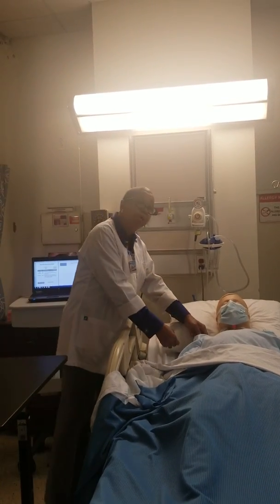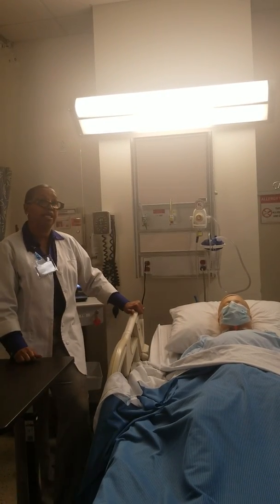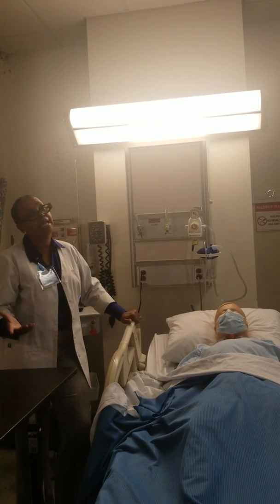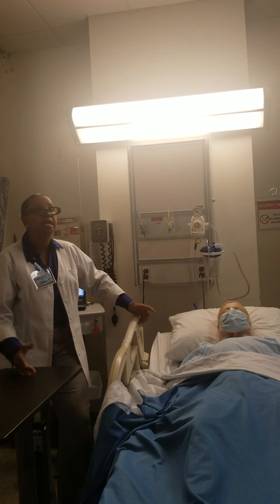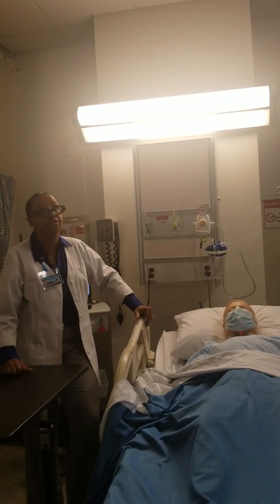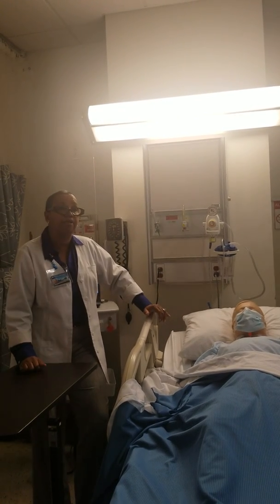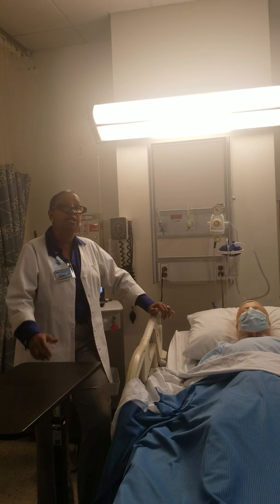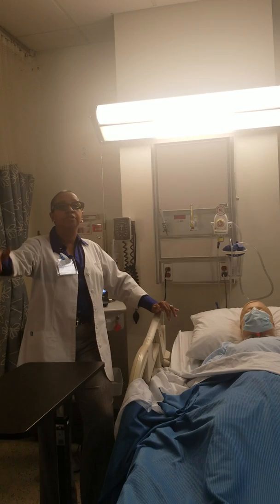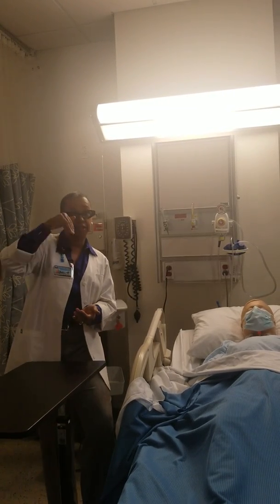Now, if I measure it before I've taken the dressing off and I see that it's further out, I might need to get a chest X-ray and make sure it's still sitting in there. That's something you would request, right? You'd say, they said he was sitting at 15 centimeters, I measured again and I have an 18 centimeter catheter outside of the insertion site. I moved 3 centimeters according to this. Am I still in the superior vena cava? They'll tell you if you're still in there. They'll tell you distal, proximal, and so on. I don't care if it's proximal or distal, as long as it's in the superior vena cava.